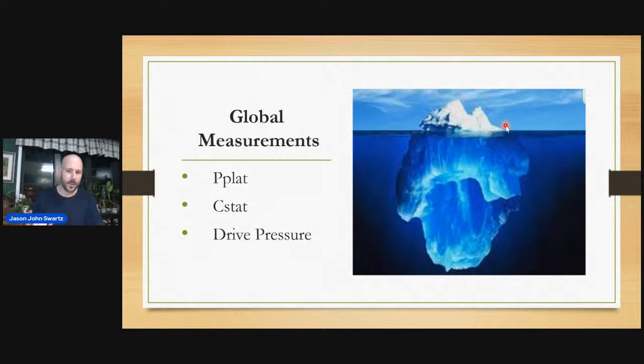So we arrive at the ventilator, and we have the tidal volume, minute ventilation, compliance, flow, and all of these pressures. So we have numerical values, and with good science over the last 2 decades, lower tidal volumes and higher PEEPs improved mortality, but we still have a long way to go. The mortality for ARDS is still unacceptably high.